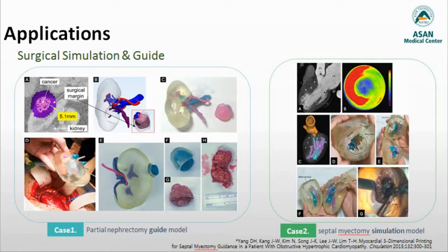These phantoms help in diagnosis and pre-surgical planning. Recently, as transparent, full-color and flexible 3D printable materials have become available, the level of realism of the 3D phantoms for surgical planning and treatment of soft organs has significantly improved.